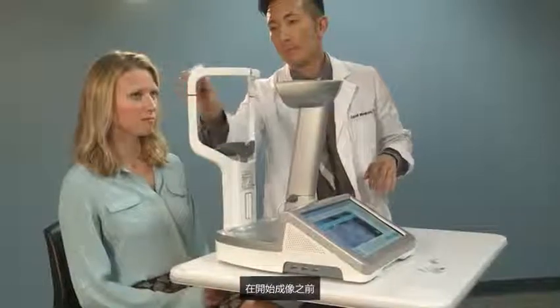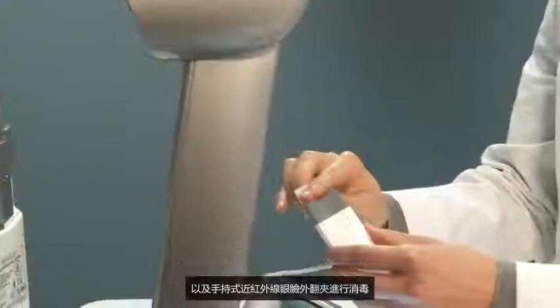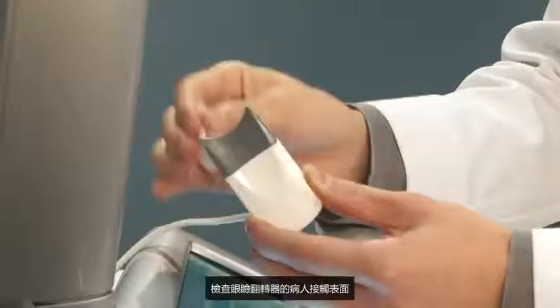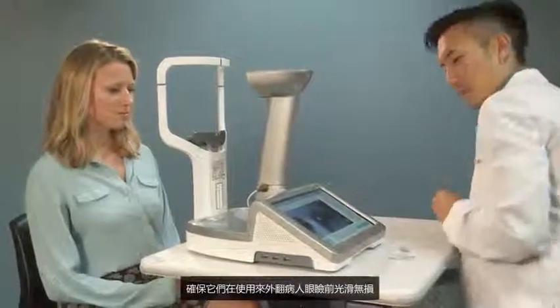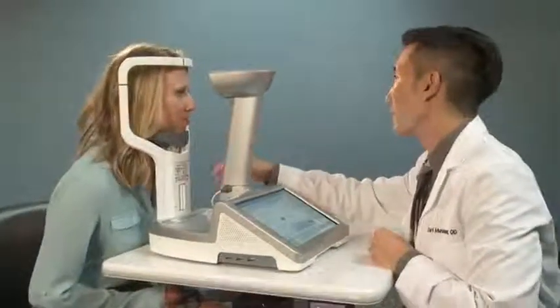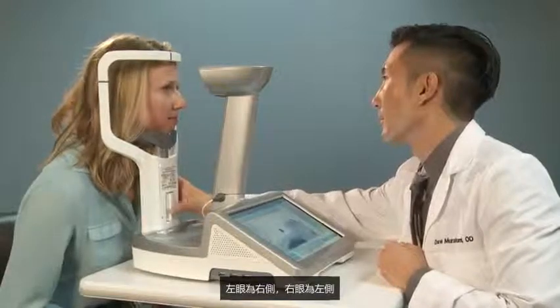Before beginning imaging, disinfect the forehead and chin rest and the handheld near IR lid everter with 70 to 90% concentration isopropyl alcohol. Inspect the patient contact surfaces of the lid everter to ensure they are smooth and intact before using to evert the patient's eyelids. Position the patient properly into the chin and forehead rest. Position the chin in the opposite direction of the eye being imaged, to the right for the left eye and to the left for the right eye.